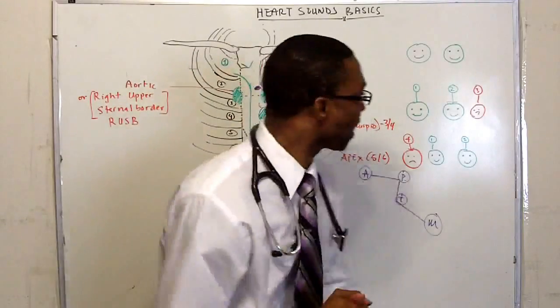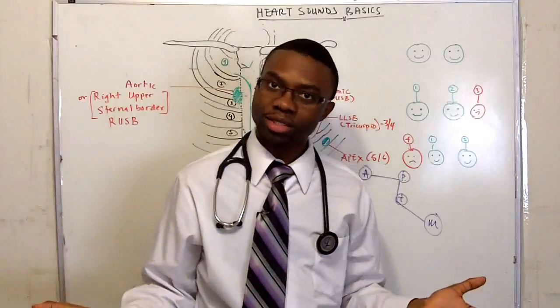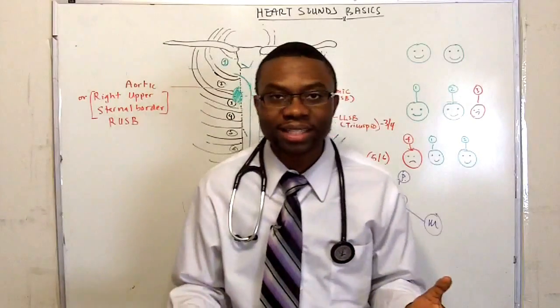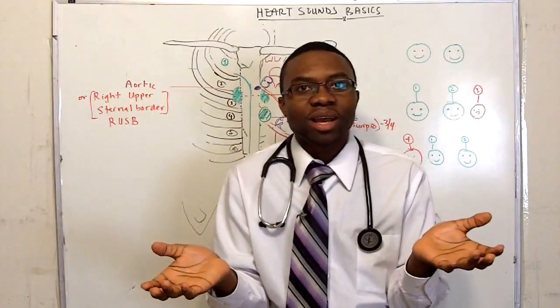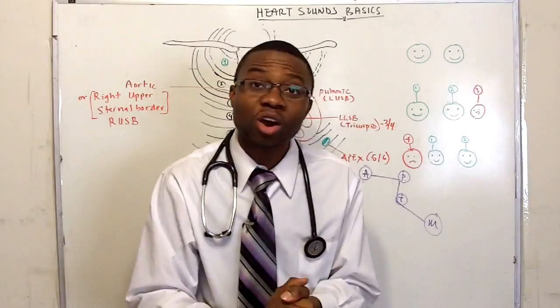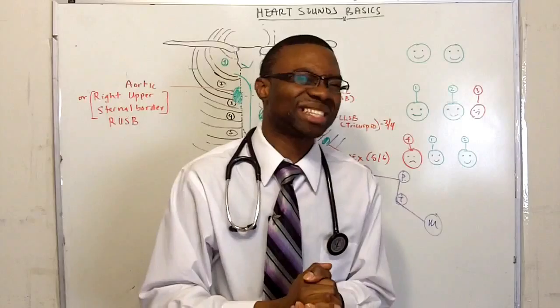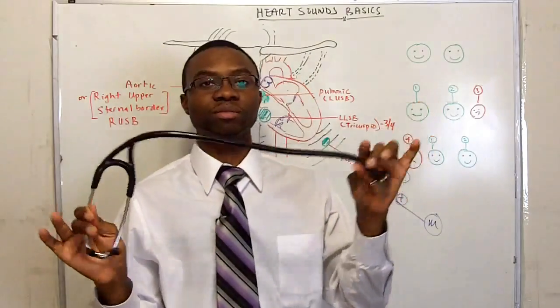Now we're going to start by using this little cartoon, guys, to learn our heart sounds. We're only going to go over the basics, and I'm going to throw in 2 pathologies. If you just know those, trust me, everything else, don't worry. We might pick it up on echo, or just say, you know what, it just doesn't sound right. So let's know the normal. Well, we're going to need a stethoscope, right?